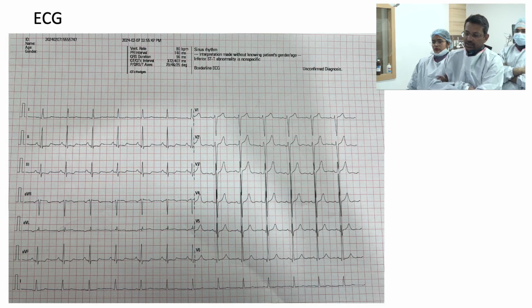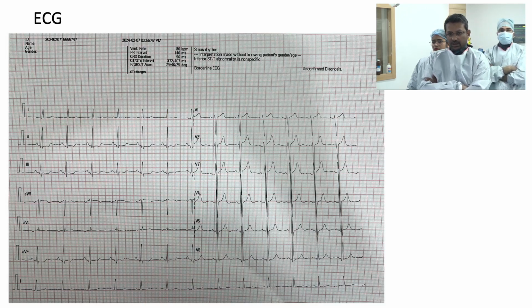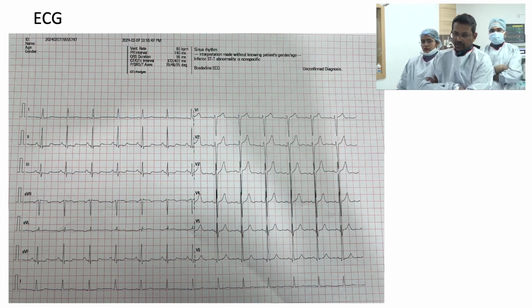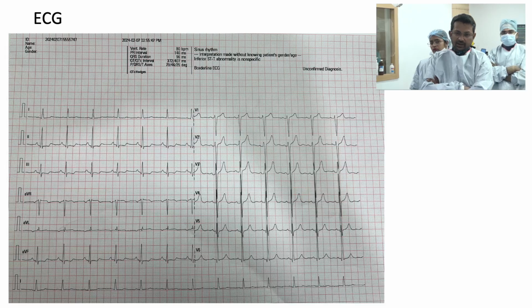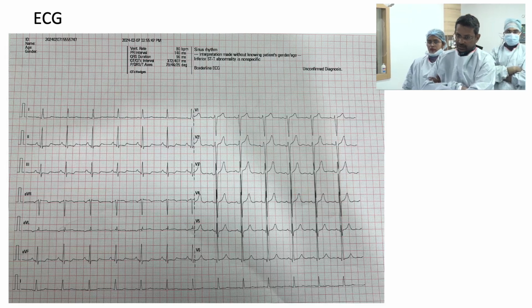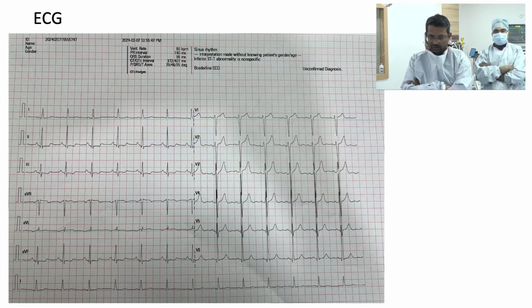The ECG shows normal sinus rhythm, LVH, and no bundle branch block. So we are expecting that we will not disturb any conduction system during the procedure.